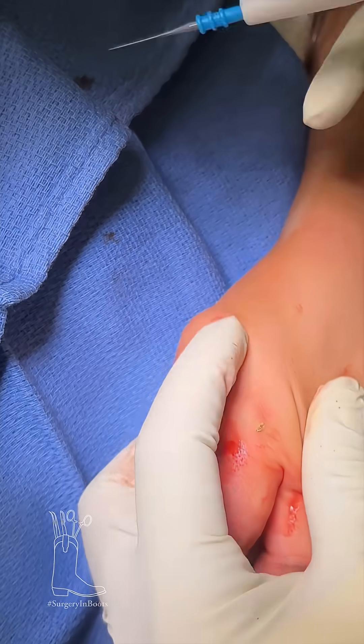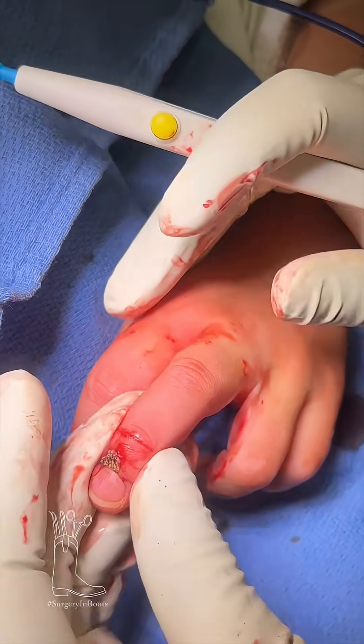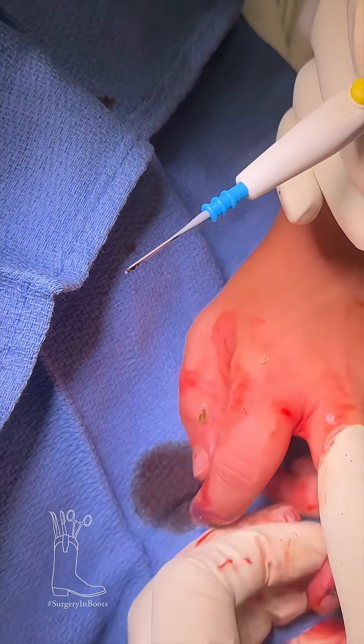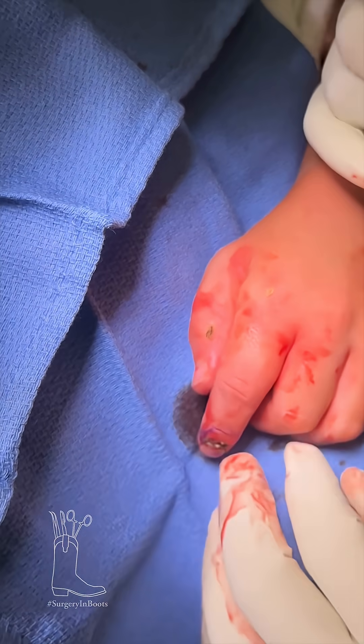I found one other little small one right there on his hand, so I went ahead and removed that while I was there. We pretty much just kind of overlook them and make sure that we didn't miss any — kind of burn them again. This is his second hand. We actually did both hands, but the left hand had the most warts, so that's the one we were watching.